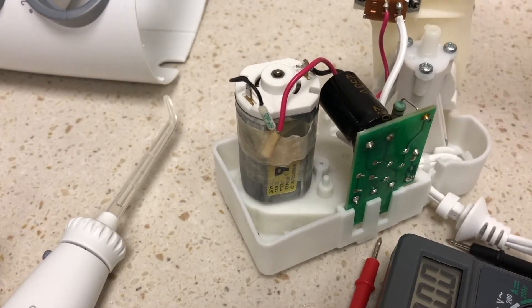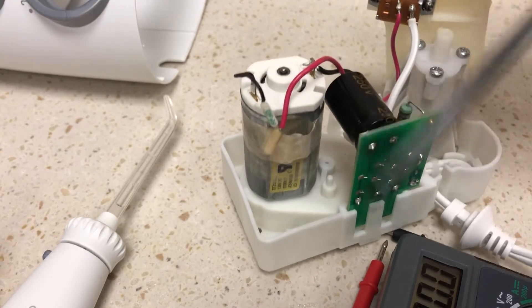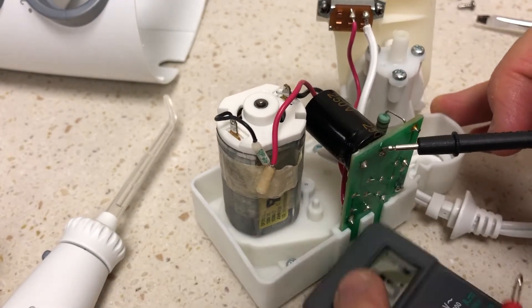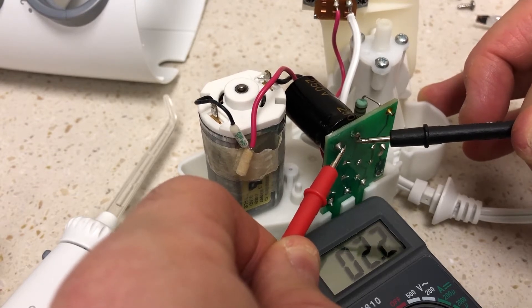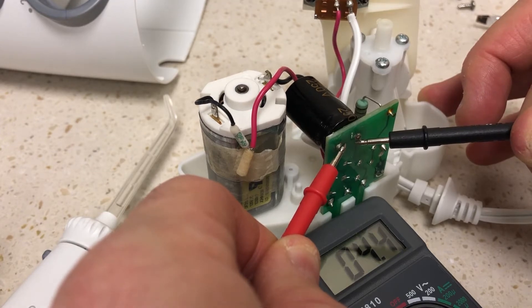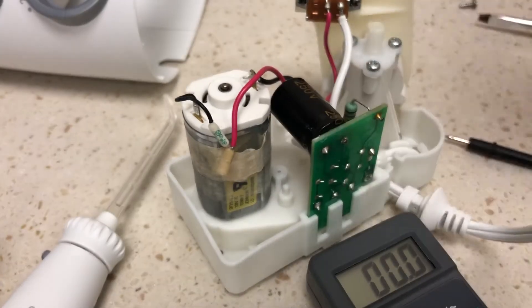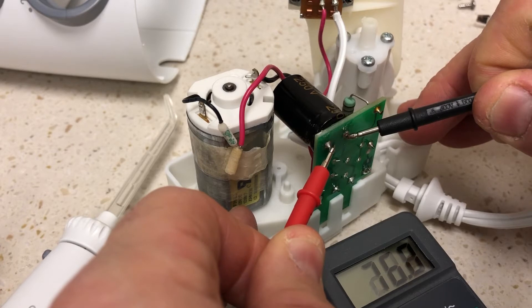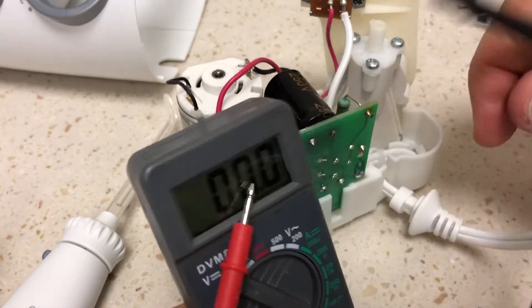It'd be nice to discharge it the slow way, but you can also do it the fast way and get a few sparks. You should have some kind of a bleeder resistor, but anyway now that it's down, the cap is unenergized — just a few volts. If I plug it in again and then unplug it, the cap charges back up and you'll be in the 160 range — 150 something volts DC.